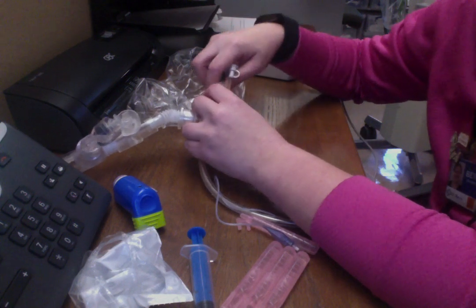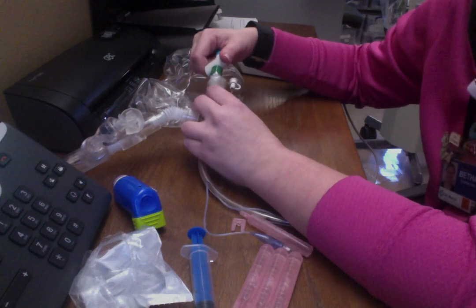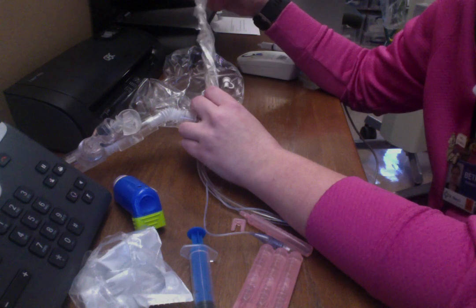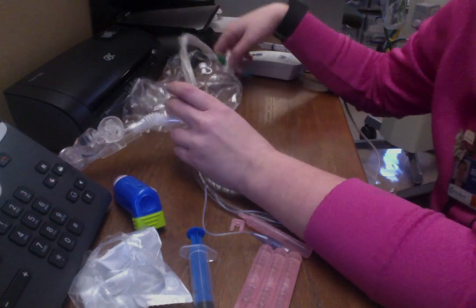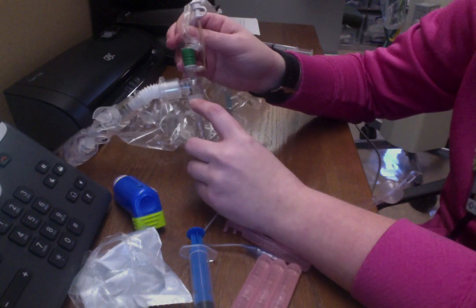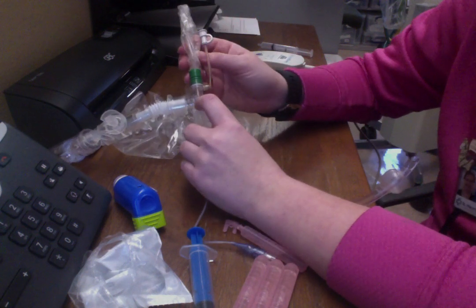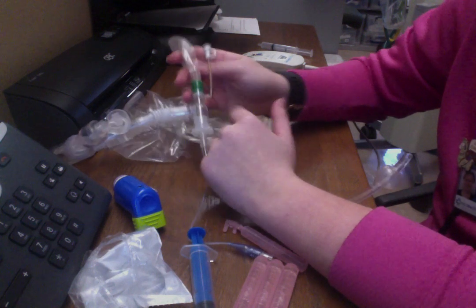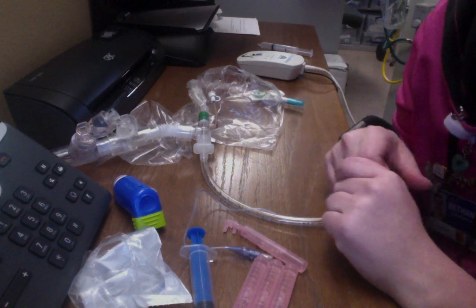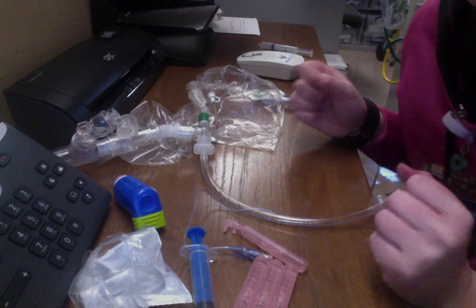Tell your patient to take a big cough. You're going to go until they gag and cough, then squeeze your suction and suction on the way out. Make sure you come all the way out until this black line right here is all the way past where your ventilator connects. Otherwise you'll be blocking and obstructing it. You'll also want to mute the alarms on your ventilator before you suction, because it will go off saying you have an airway obstruction.